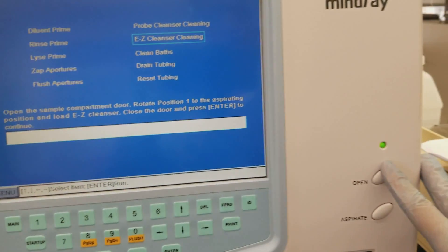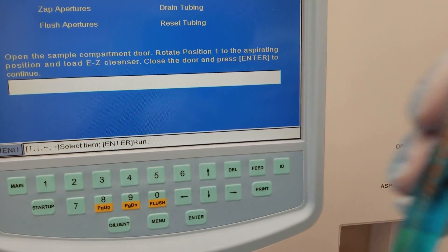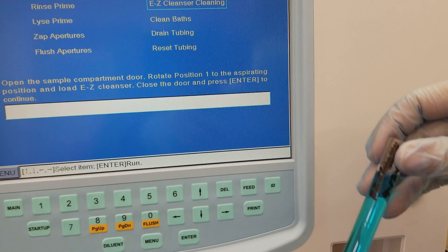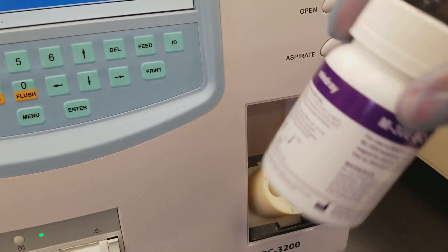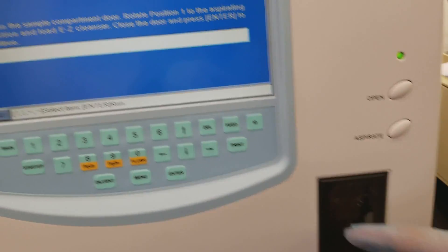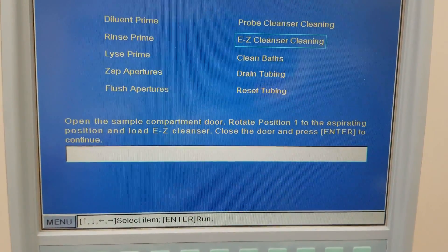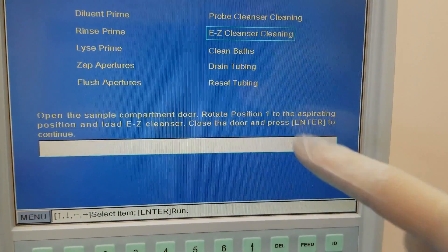Rotation one — we always do that. Open this and put three to five milliliters of the Easy Cleanser in here. Make sure you swirl the cleanser — any type of reagent — before you actually use it. Then close the door and press Enter.